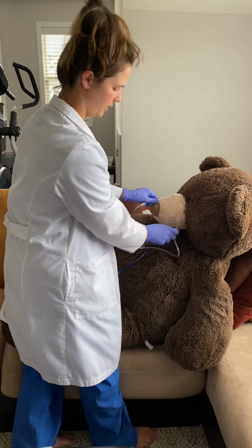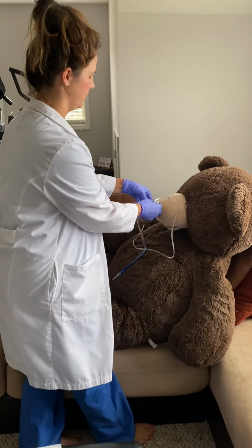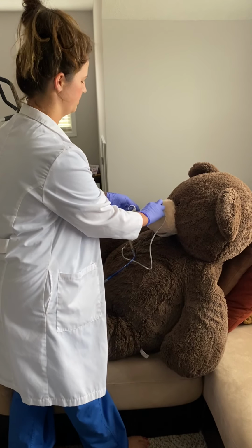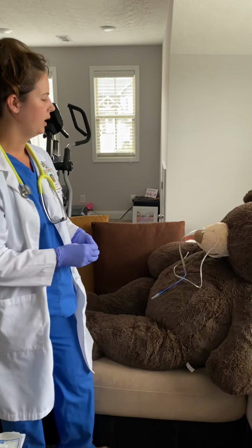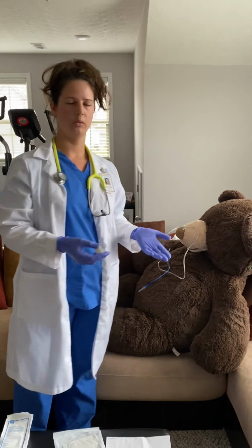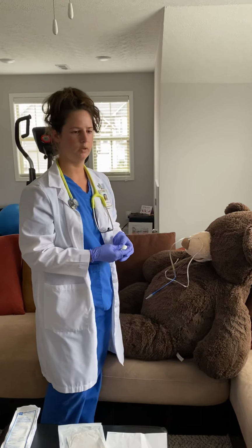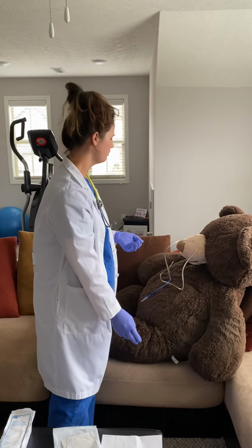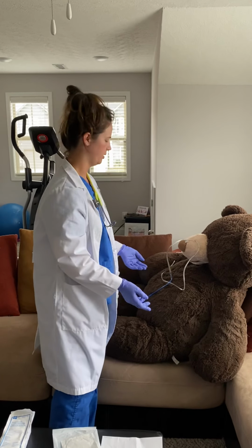All right, so once you hit that, you're going to take your piece of tape and you're going to anchor it temporarily while you confirm your placement of your tube. And you just want to refer again to your facility policy. Most places are going to have you do an x-ray to confirm placement. Others may have you check the pH of aspirated fluid from the stomach. But again, just follow your facility policy.